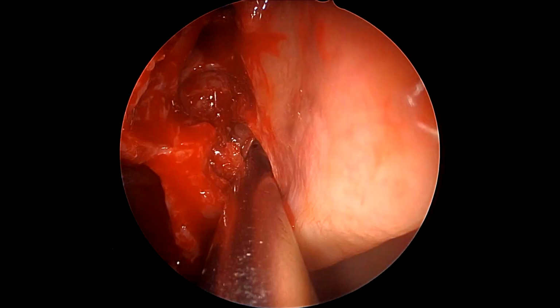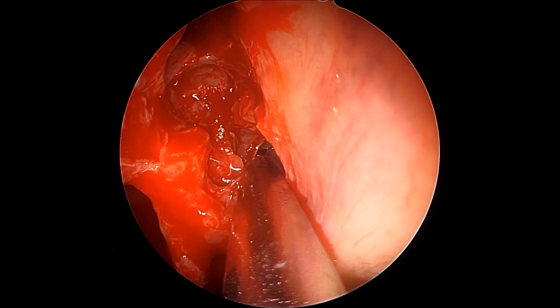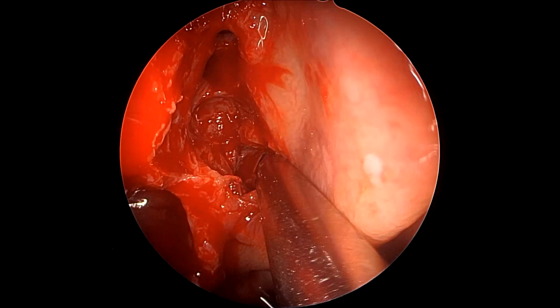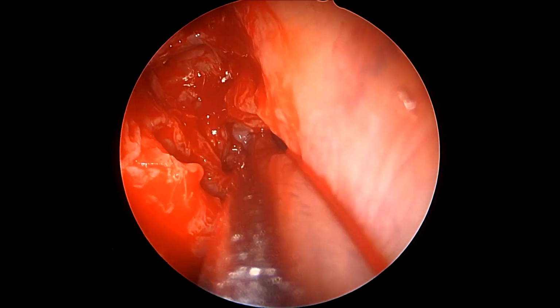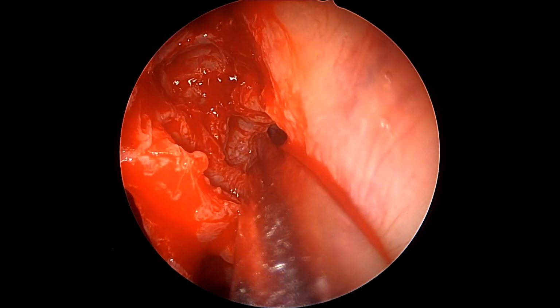As we can see here, post removal of the superior turbinate, we have taken a shaver blade medial to it, following the septum, and right at the level of the horizontal antrostomy ridge or the medial orbital floor, we have just entered our sphenoid sinus.